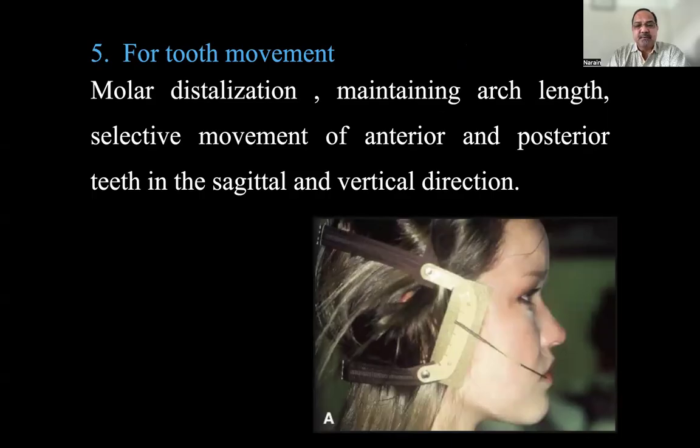And number 5 is for tooth movement, mainly in molar distalization. So these are the various uses of the headgear. Of course, now with the advent of temporary anchorage devices, the use of headgears has been reduced, but it cannot be replaced in growth modulation, especially.